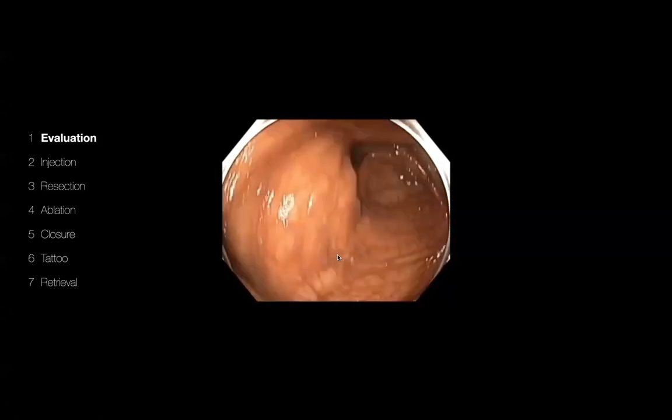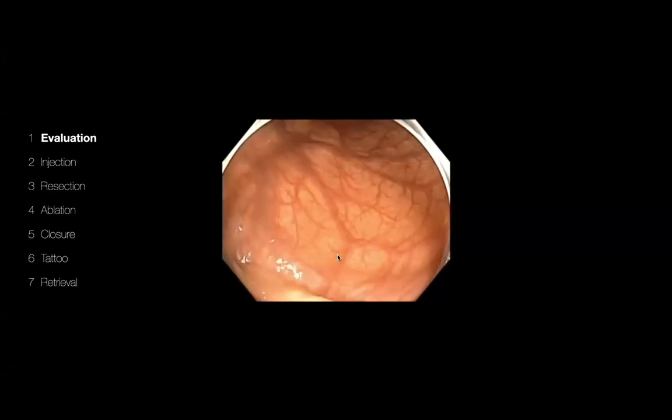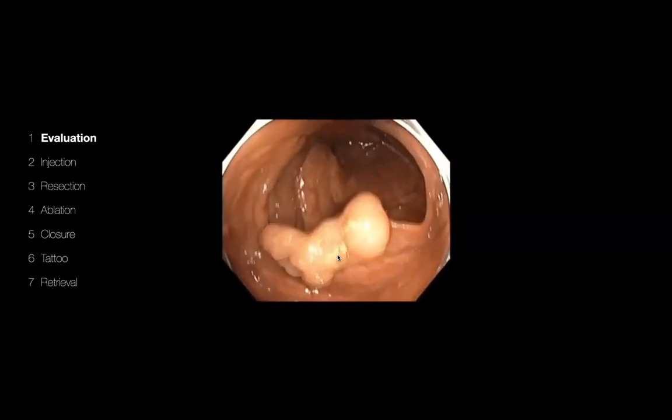So this is actually a 53-year-old man, one of my colleagues from MD Anderson, who came for colon cancer screening, first colonoscopy, no family history, not a smoker, not obese, and he had a very long colon. And I was happy that I didn't see anything until I came to just above the ileocecal valve. This is about a couple of folds above the ileocecal valve, and I see this polyp.